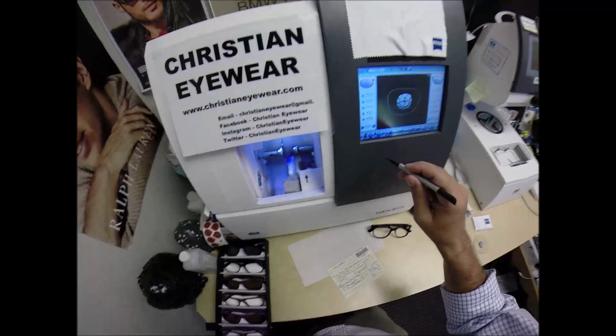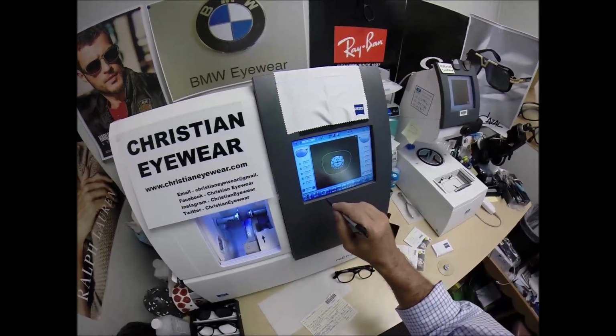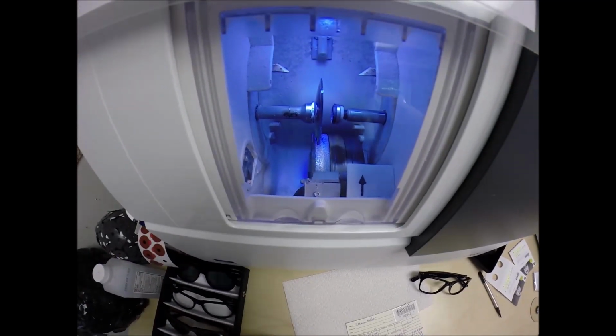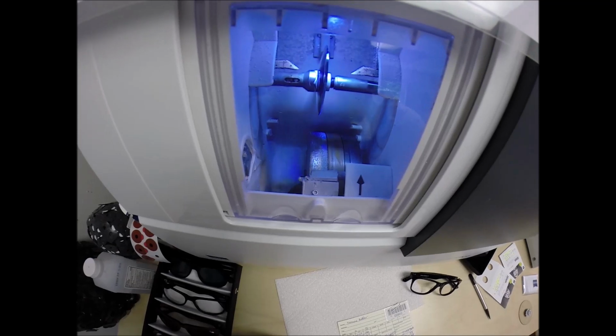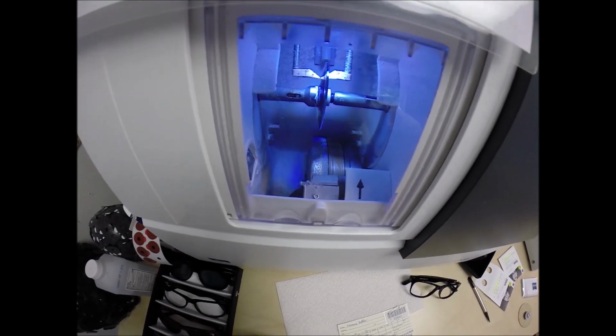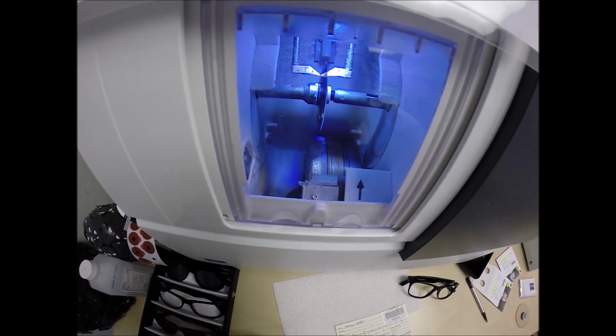So, did I mention free bad jokes with the purchase of every pair of glasses? So I'm going to hit the green start button. The clean door closes. I've been criticized in other videos that I need to clean the door. So for the inaugural video for Christian Eyewear, I cleaned the door. Jeff, down in Florida, I hope you're happy.